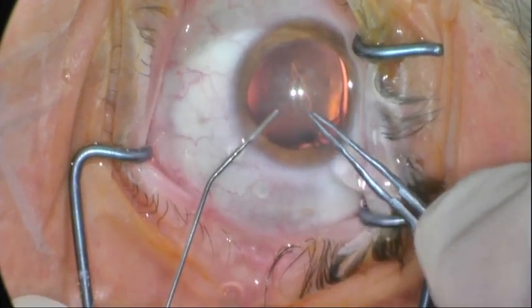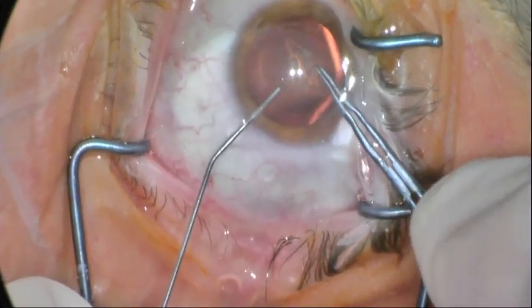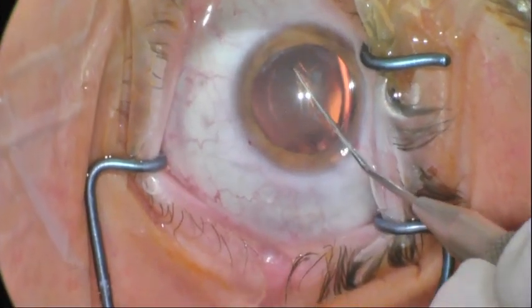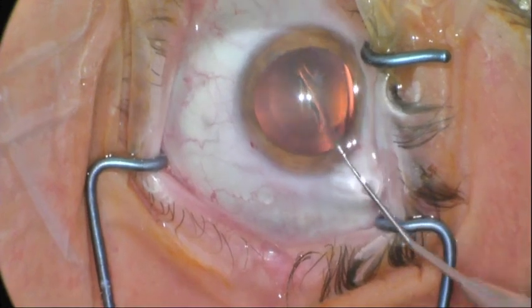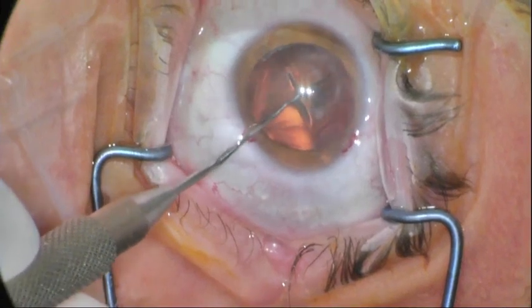And I'll show you what we're going to do to achieve this goal. Proceed with a continuous curvilinear capsularexis, and then instead of proceeding with hydrodelineation or hydrodissection, we'll weaken the lens with a Nagahara instrument by scoring it 30 to 40 to 50% of its depth. Watch the anterior capsule when you do that. It's easier if you separate your wounds, as I've done here.